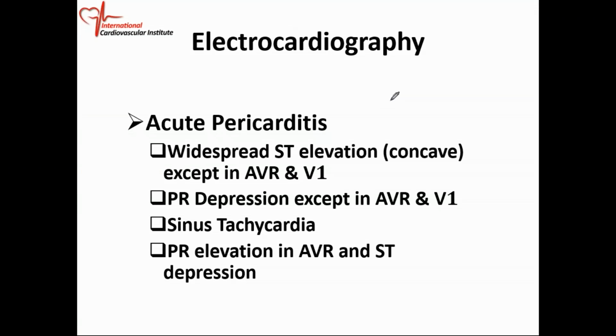For the heart attack, the ST segment usually looks like that. It usually curves up like that. So your ST segment for a heart attack is going to look something like that, as opposed to your ST segment for pericarditis, which is going to look like that. So we say it's concave.